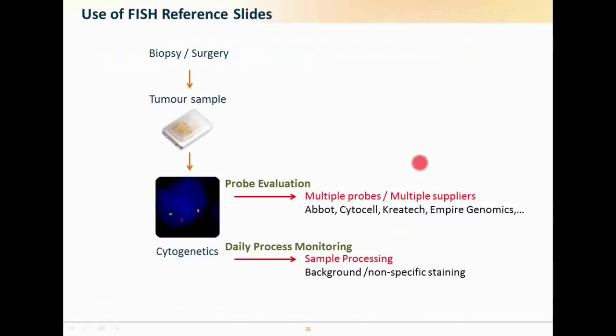So how we would suggest that you can use reference slides is certainly at the stage of evaluating probes, or even if you're looking at switching between suppliers. So you have reference material to ask, does my probe work with this slide? Yes, it does. Okay, we'll bring in another probe, and then we can test it again.